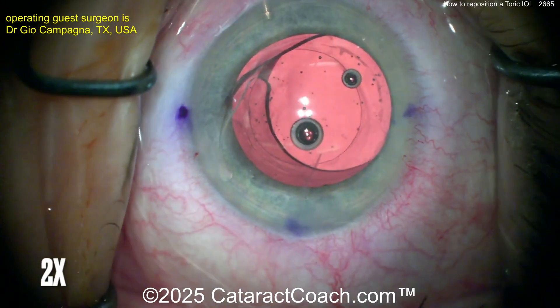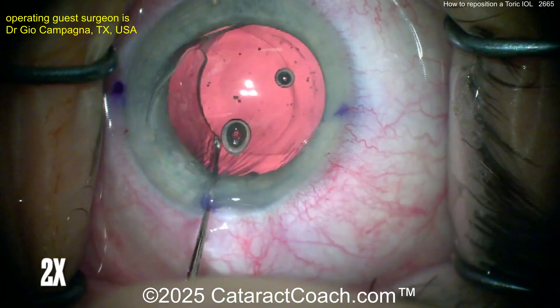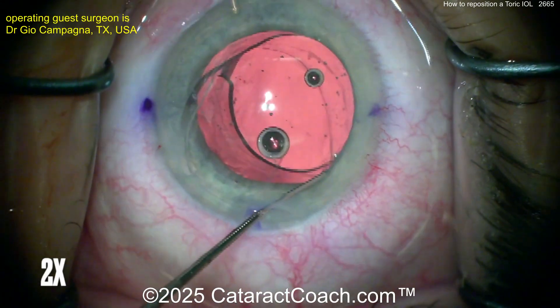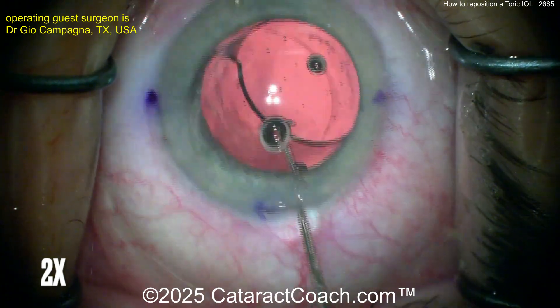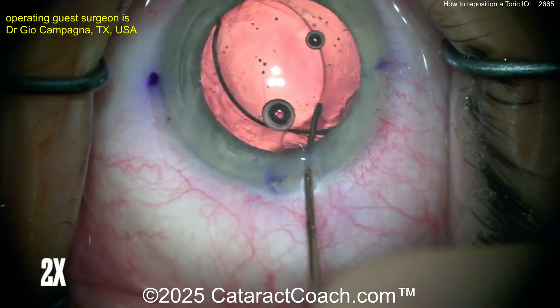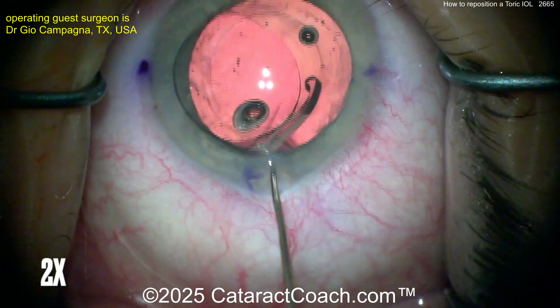Now the surgeon can bring the whole lens up — you can even get it out of the anterior chamber, that's no problem. The spherical power is good, so the lens itself is going to be kept. You're not going to explant it; it's just repositioning. Get the other haptic freed up as well. Now look at the orientation of the haptics — it's easier to rotate these lenses clockwise than counterclockwise, because clockwise goes with the flow of the haptics. Counterclockwise, those haptic ends push into the capsule bag.